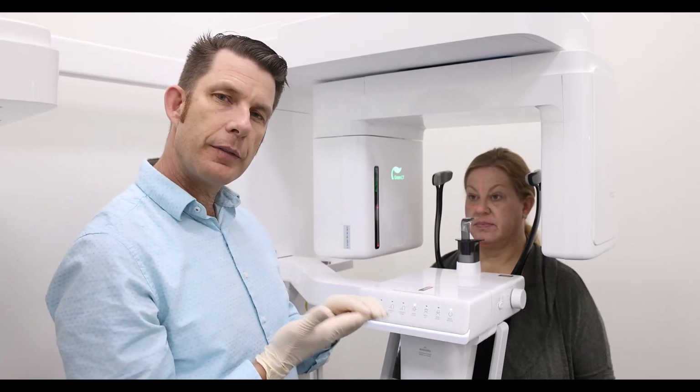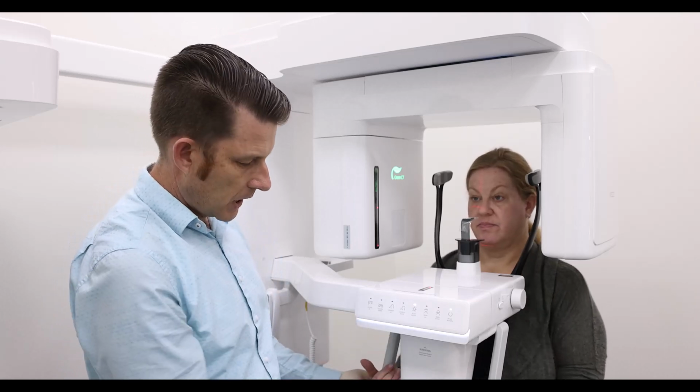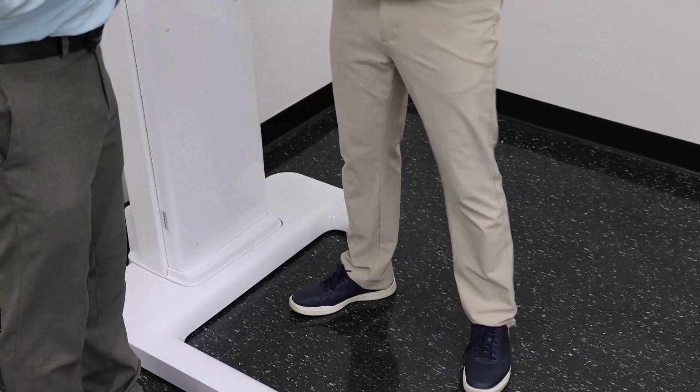A couple things to start with for patient positioning. I'm going to start with the hands. Go ahead and hands palm facing up. Go ahead and walk forward, feet shoulder length apart. Then I'm going to have the patient bite on the bite stick.